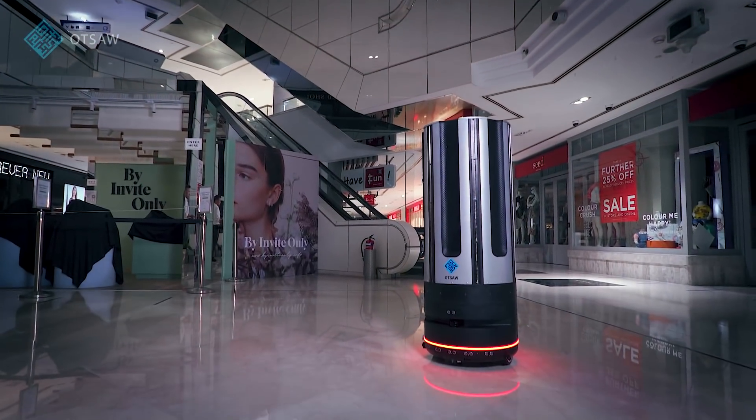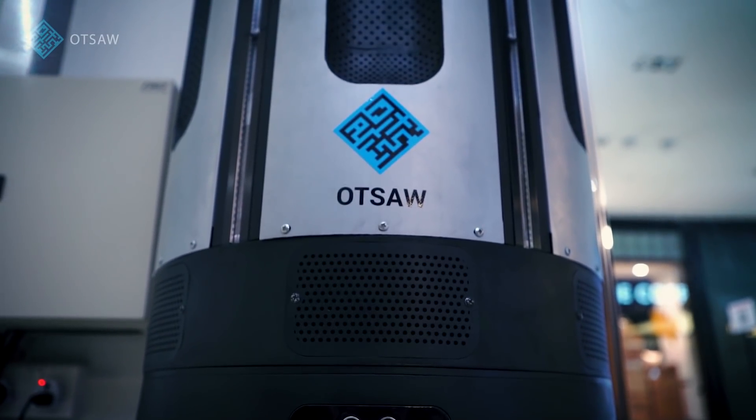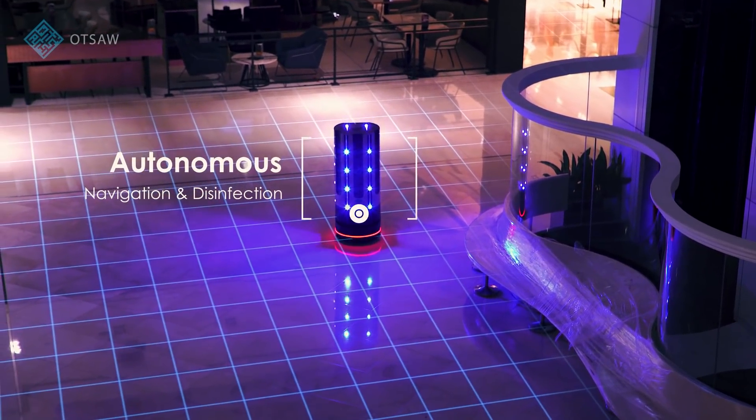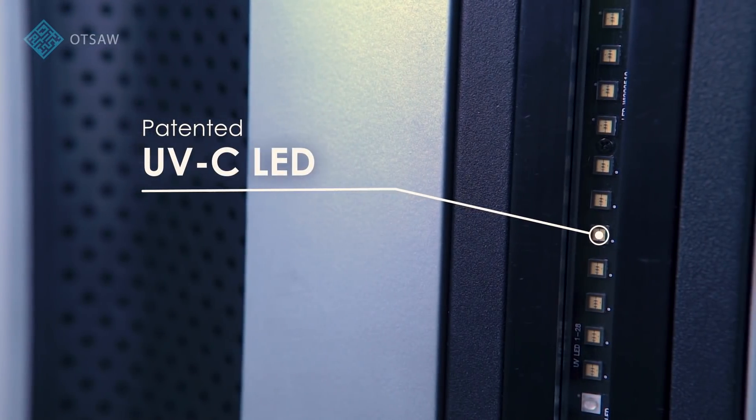This machine is packed full of cutting-edge technology developed with sustainability in mind. The ORX is capable of autonomously navigating and disinfecting up to 4,000 square feet per hour using OTSA's patented UVC LED technology.